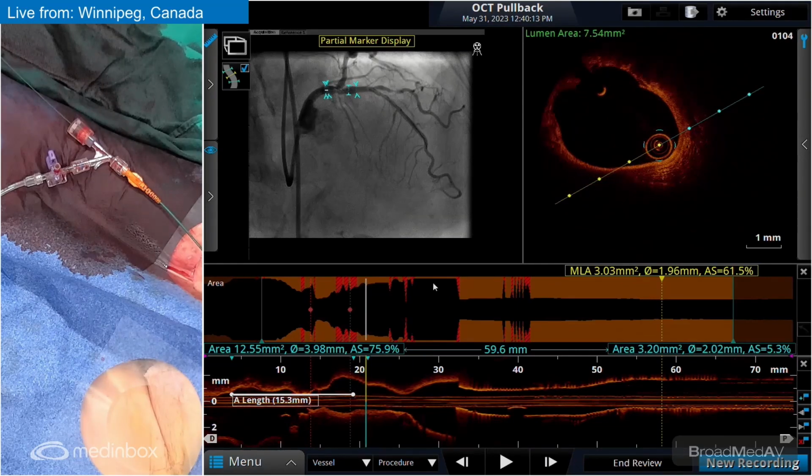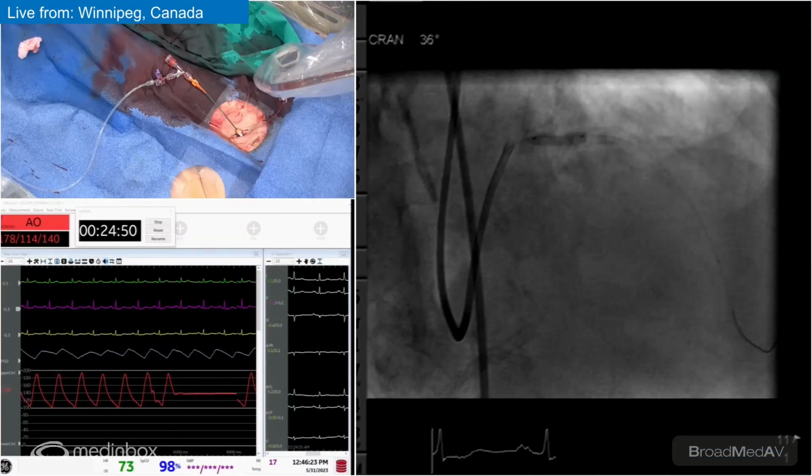Yep, we could go with a 4.0. It gives you lots of room to go up to 5.75, not that we're planning to go that big. Yep, 4.0/16. Let's go with a 3.5/16. You want a 4.0? I'm swayable, I'm not committed. Let's get a 4.0/16. Yes, let's get that. We can get another round of sedation as well. Perfect. Yeah, Dr. Gupta's on that.